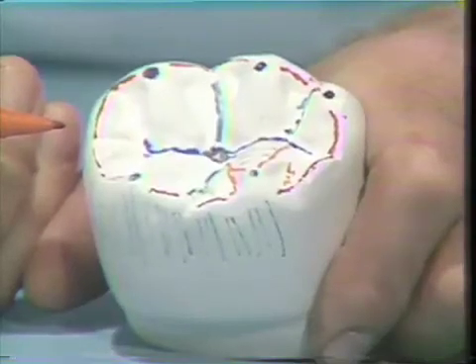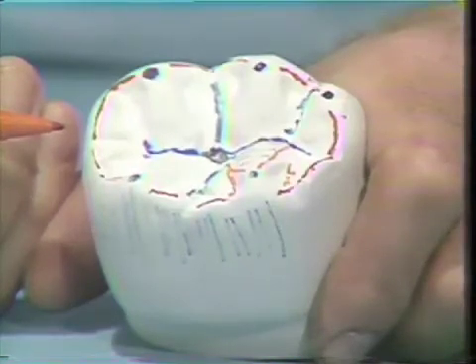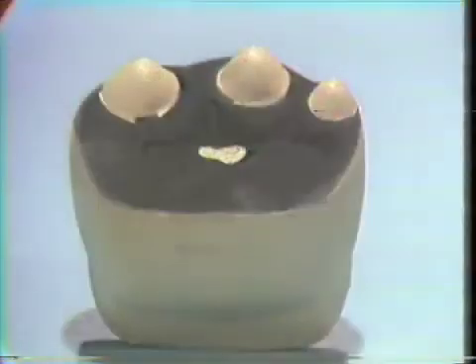We'll see the tooth built up on a series of models that will represent starting from the cusp tips and then progress through to the completed occlusal morphology. On the first series of models, we'll see the cusp tips.